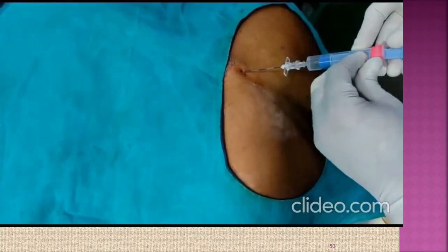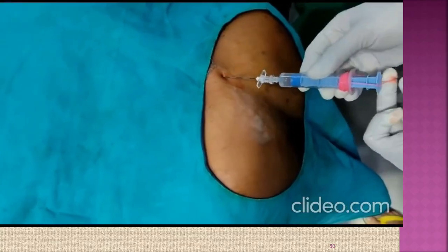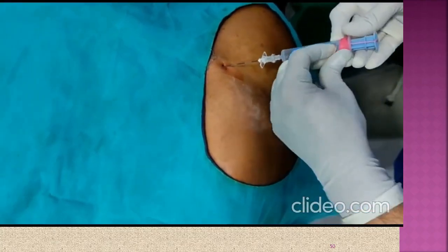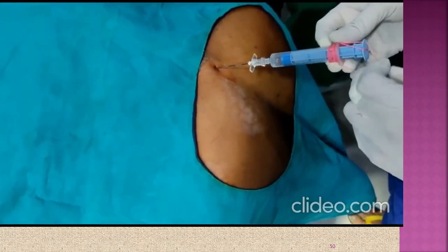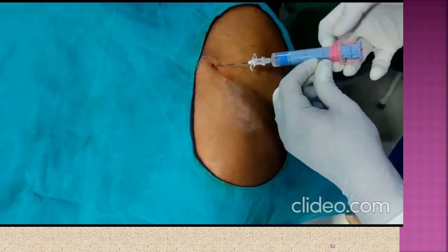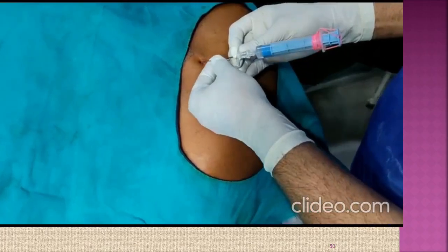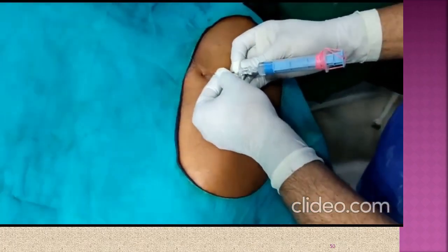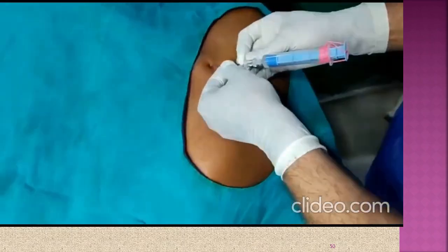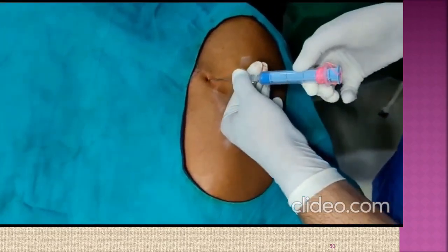After all aseptic precautions and local infiltration, the needle is pierced and as soon as the interspinous ligament is reached, the syringe is attached, rubber bands are attached to the slots and the needle is advanced slowly. Thus we can see the space is detected.